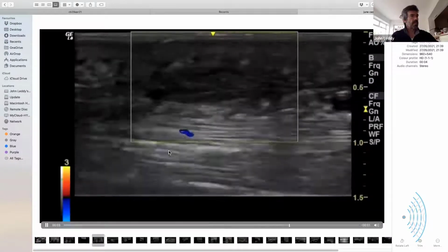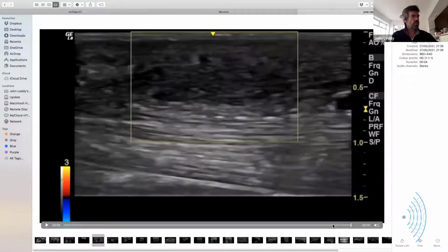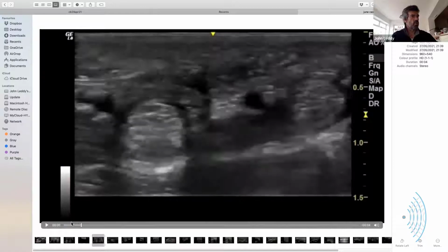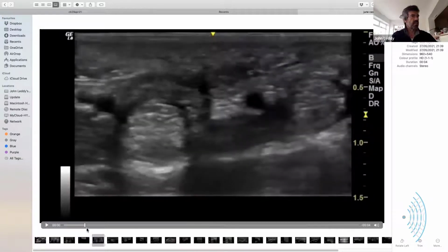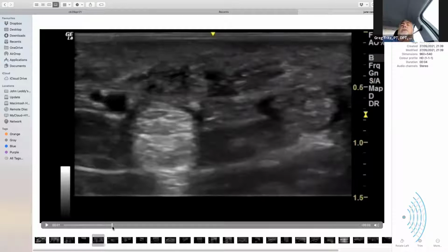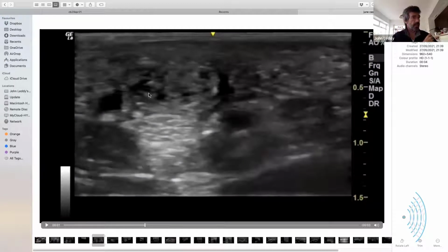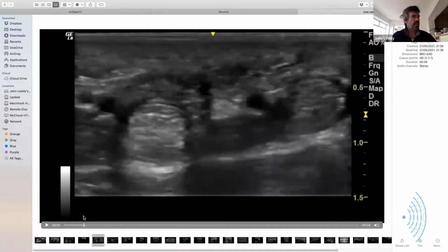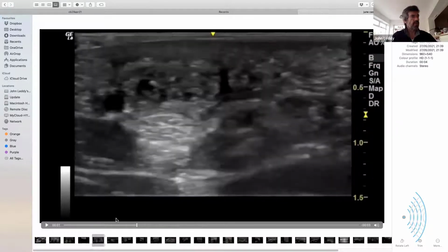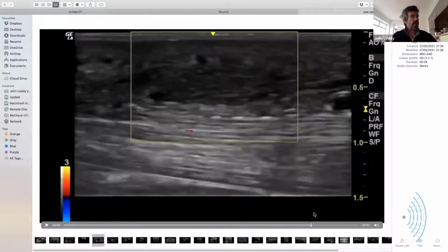This, you see, okay, have you got it on the screen? Yes, I do. I have a good view of it. This is just a short clip of a very, very thick bit. You don't normally see it this large. And if you put your eye on the tendon there, short axis in the palm, you see the swelling here. It doesn't look like much, but if you go back, you'll see that it grows out of almost nothing. And then it carries on, and that's it in long section.